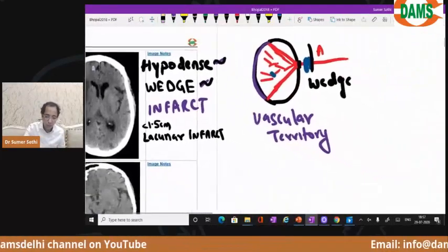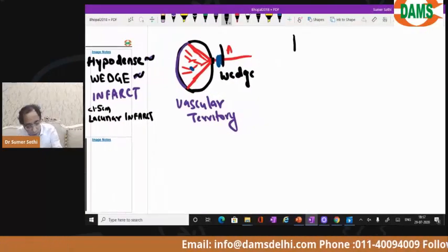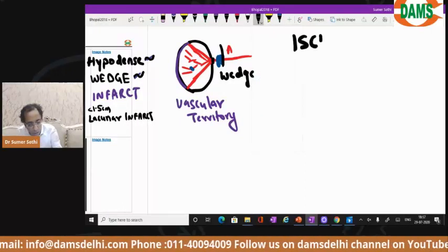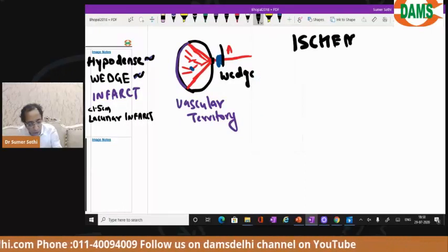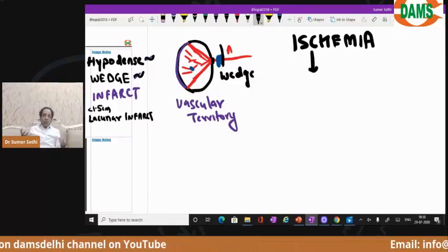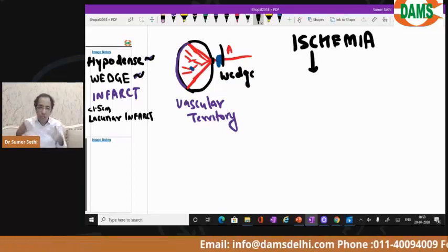Now my question is, why is it hypodense? Let's try to understand. Suppose an artery is blocked in the brain, so the blood supply of the brain is compromised. We will call it ischemia. Why do we need blood supply to the brain? Because we need oxygen.